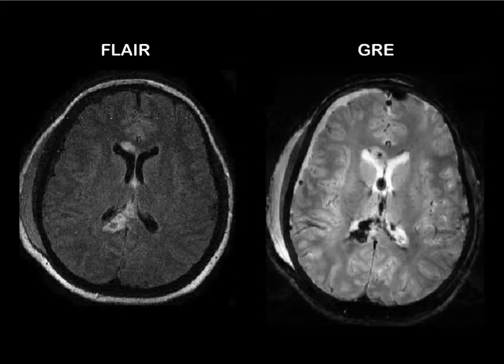And you can see that in the same region where you have this FLAIR hyperintense signal, you can also identify a hypointense signal on gradient echo, and this suggests that there has been focal hemorrhage. In many cases, lesions of this type will be either not seen or very poorly identified using CT scan.